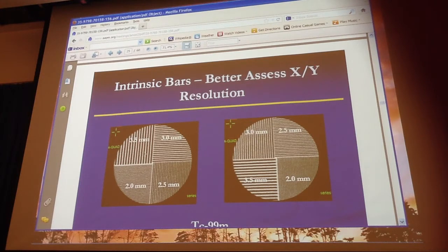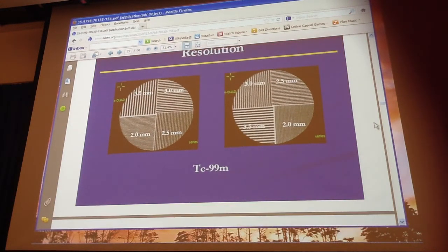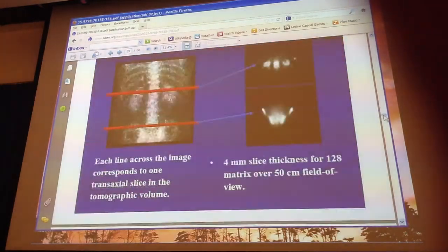The bars help? Yeah, what would I look for on the bars? Wrong numbers. Yeah. Wrong numbers. Right, if I count the number of bars, I should have the same number of bars in the X and the Y orientation. Remember, you're supposed to every day turn that thing 90 degrees. You're actually supposed to take 4 images of this. If I count the number of bars, I should have the same number of bars in each direction that this thing rotates. So, in this case here, when I turn it to the Y, if I rotate that at 90 degrees, I'm not going to have the same number of bars, I'm going to have less. Okay, because it's my Y position that's a problem.